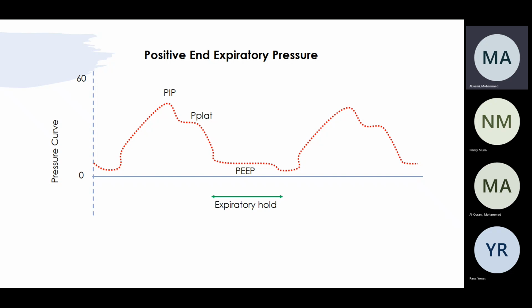And guys, I've seen that done a lot. With the patient on expiratory hold, the curve will be moving up and down, and the machine will give you a number and you will just take it. If the patient is making an effort and there are changes in that line, if it's not a straight, steady line, you cannot take it. Or you can do it yourself: freeze the image, find the exact steady line, and then measure your PEEP.